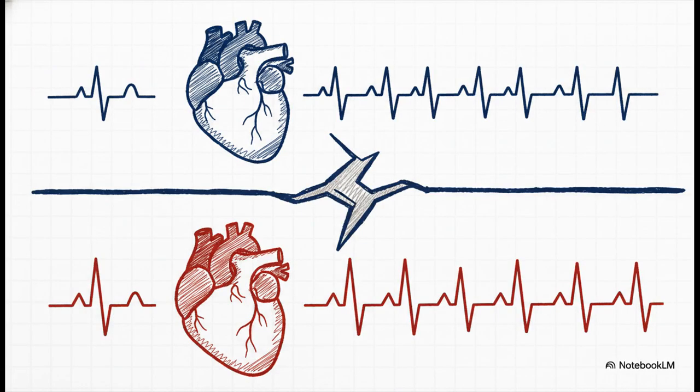And third degree, it's total war. The atria and ventricles are completely independent. You have to know the interval, spot the drop, and save the rhythm.